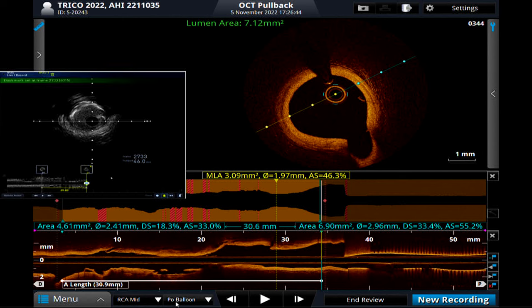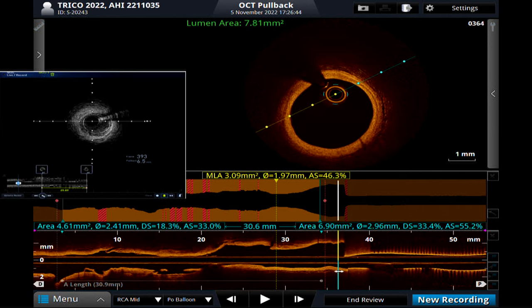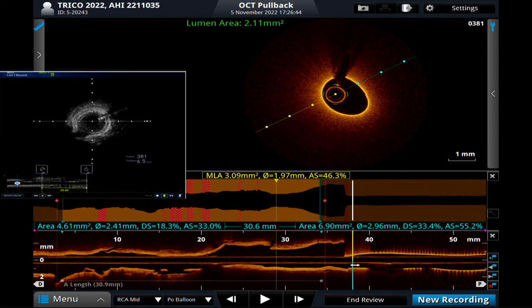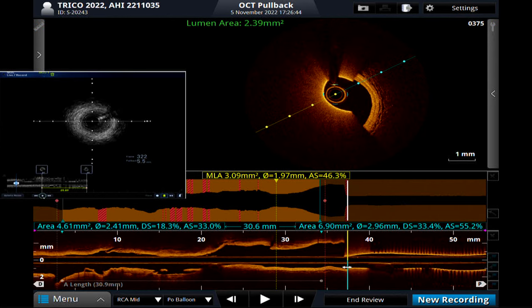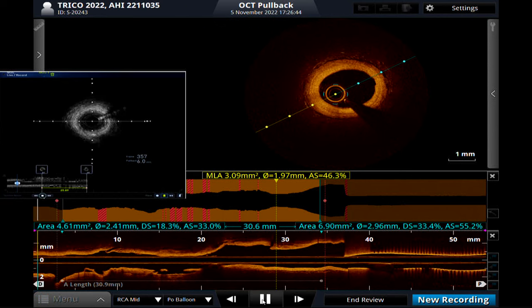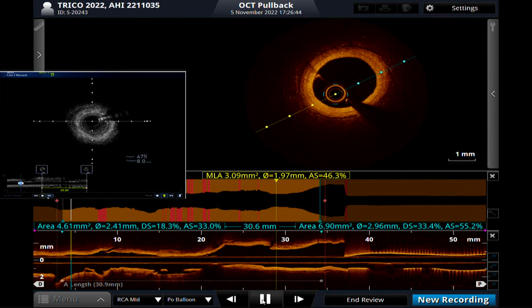By the time I am deploying the stent, please run both images simultaneously — they are already running on two screens. Length: 32–33mm. We can take a 3×33. I need good radial strength here — I will go with the Alpine 3×33.